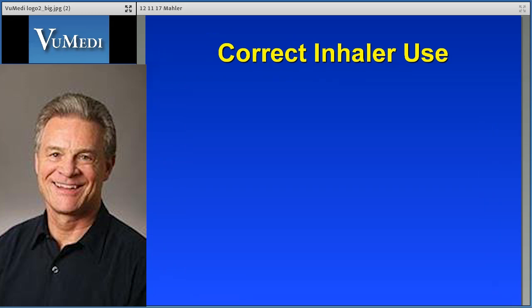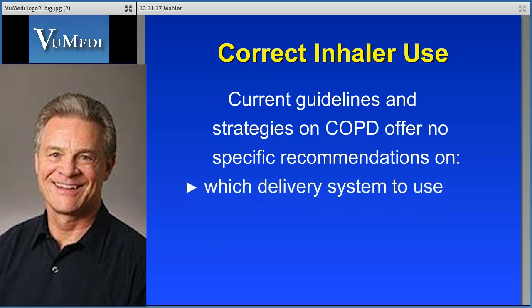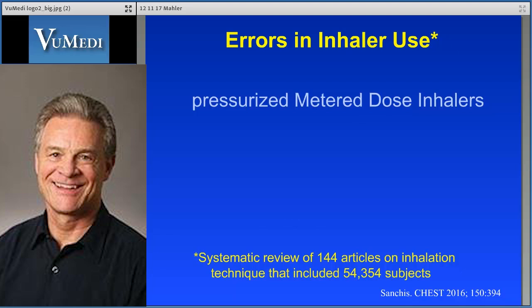We have some challenges in correct inhaler use. First, current guidelines and strategies on COPD offer no specific recommendations on which delivery system to use, in which patient type, to achieve optimal clinical outcomes. In addition, there are well-documented errors that occur among patients using inhalers.